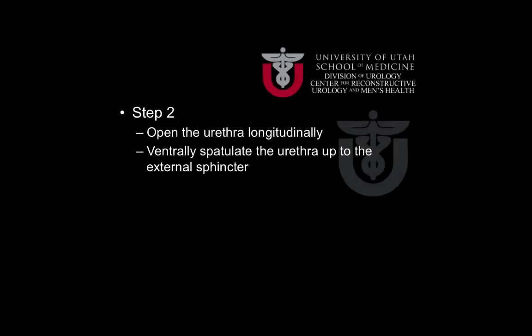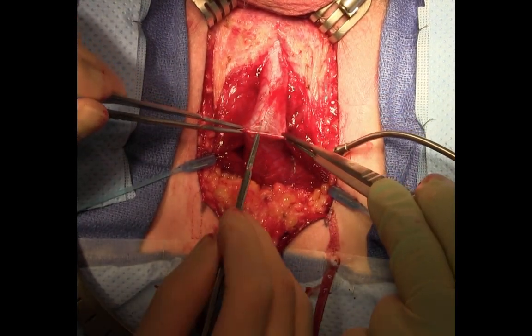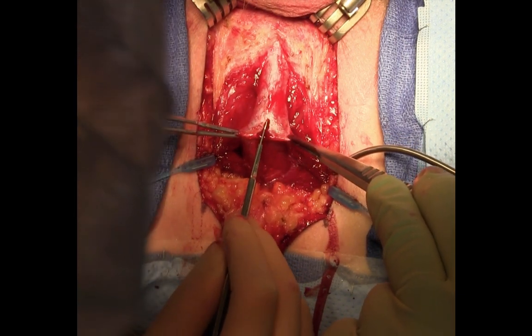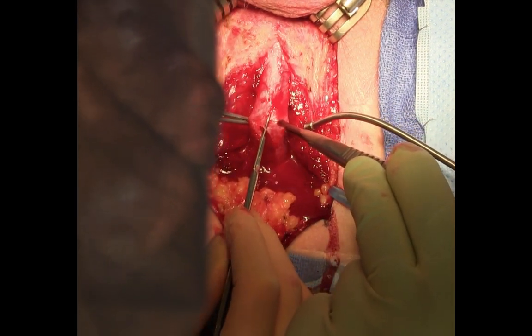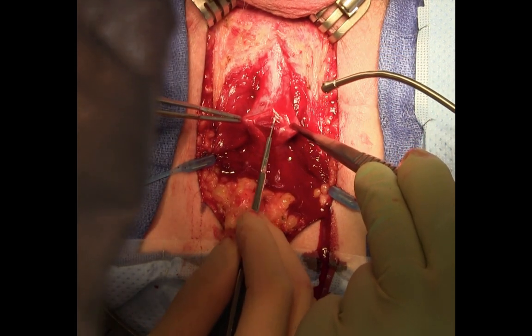The next step of the surgery is to open the urethra longitudinally. This longitudinal urethrotomy preserves blood flow within the urethra. The urethra is ventrally spatulated up to the level of the external sphincter. Here you can see the ventral opening of the urethra. It's very easy to get off the midline and skive to one or the other side of the urethra. It's important to look out for the slight whitening associated with the midline of the urethra.